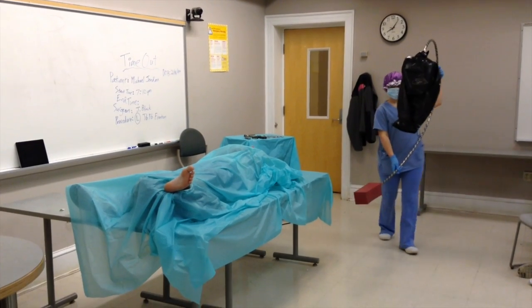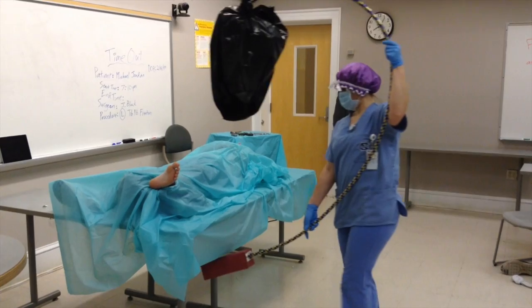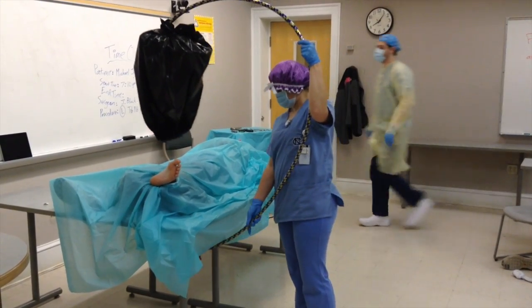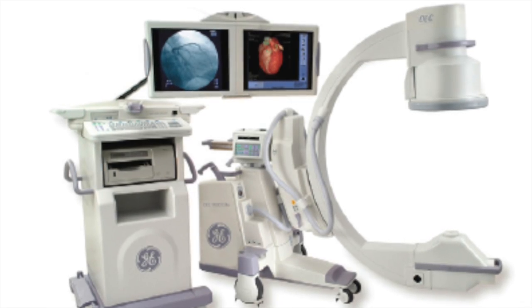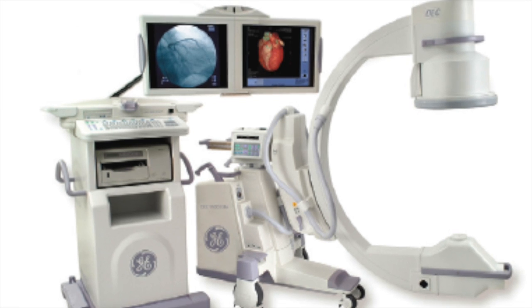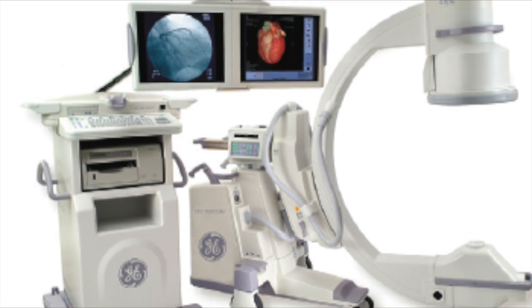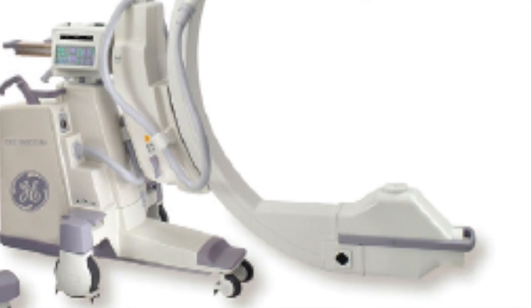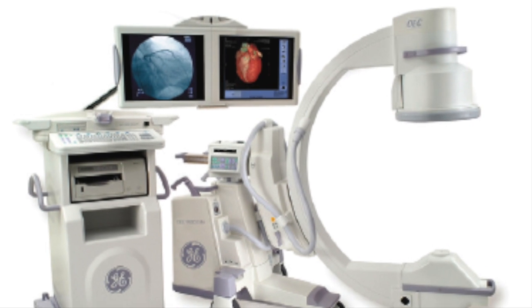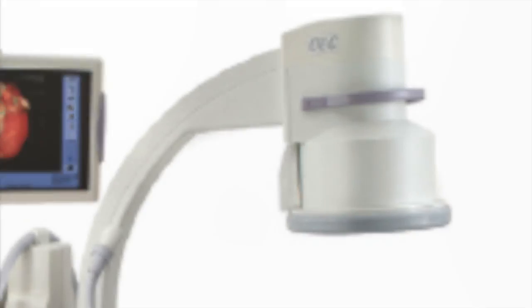Knowing your equipment. The radiographer should be well informed and familiar with the equipment he or she will be working with. Most radiographic and fluoroscopic procedures in the OR are performed with mobile equipment. Mobile fluoroscopic units, referred to as C-arms because of their shape, are the most common imaging equipment used for surgical procedures. On one end of the C-arm, there is an X-ray tube for producing the exposure, and on the other, an image intensifier or flat panel detector for receiving the exposure.